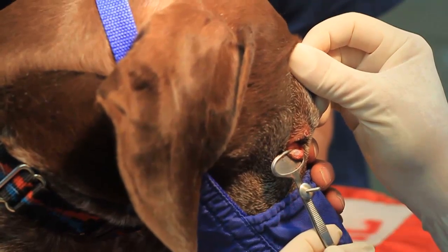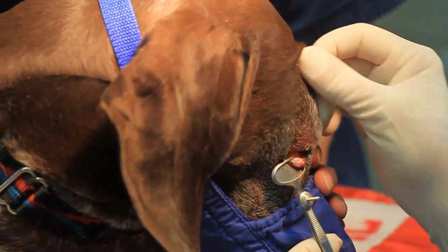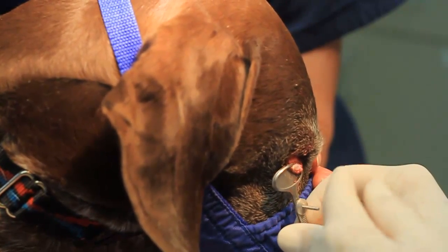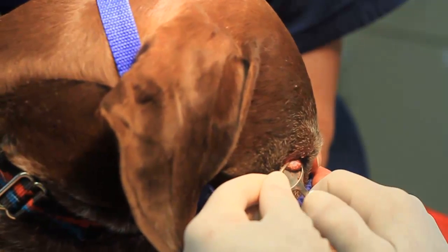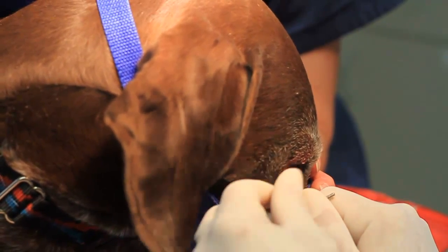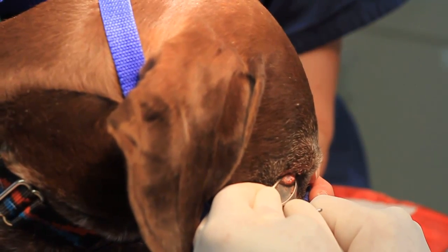I always have the dog stay in the clinic for a couple hours afterwards because this thing is going to bleed a lot — there won't be anything tied off. Some people are using laser to remove these; there's an ophthalmologist at Kansas State that uses laser, but everybody else I know is using cryo. The cryo unit is very inexpensive so it pays for itself really quickly.